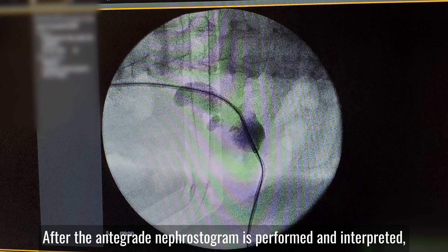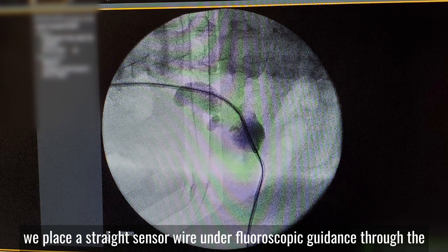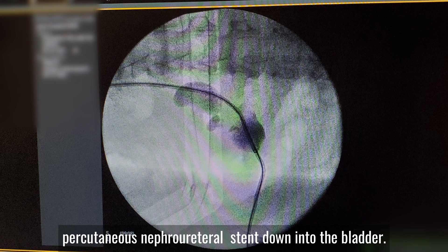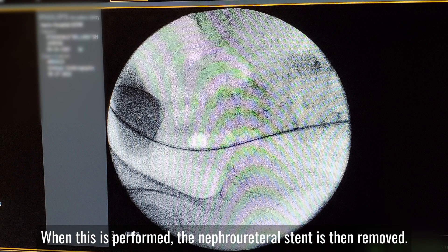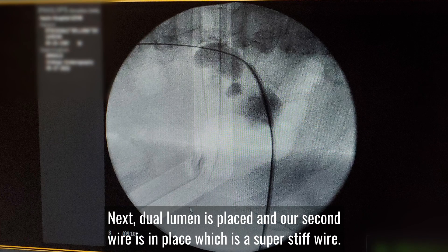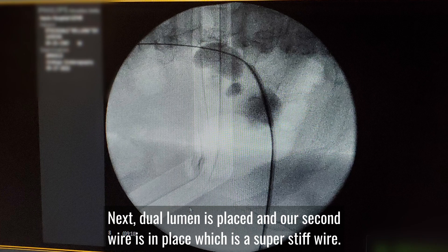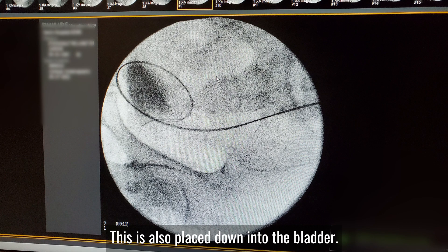After the antegrade nephrostogram is performed and interpreted, we place a straight sensor wire under fluoroscopic guidance through the percutaneous nephro-ureteral stent down into the bladder. Once this is performed, the nephro-ureteral stent is then removed. Next, a dual lumen is placed and our second wire — a super stiff wire — is also placed down into the bladder.